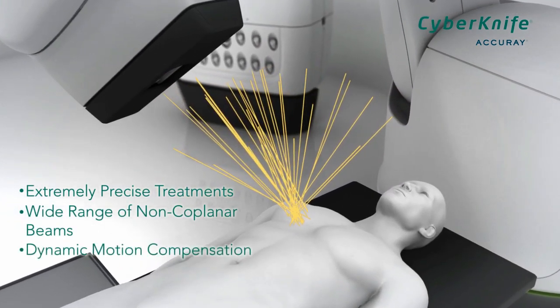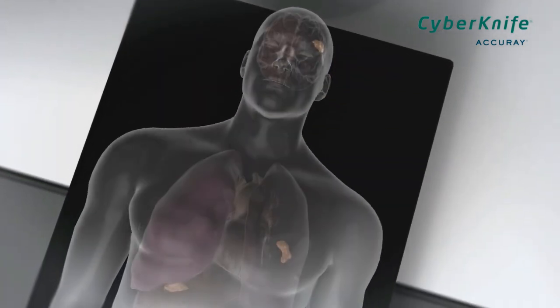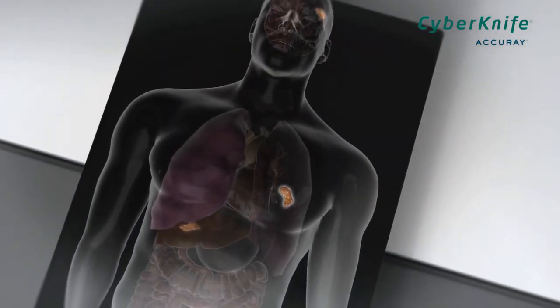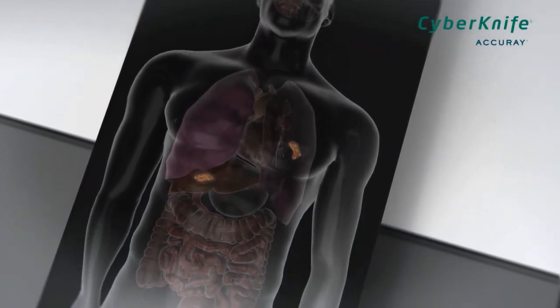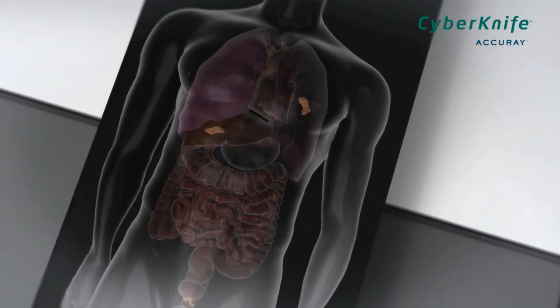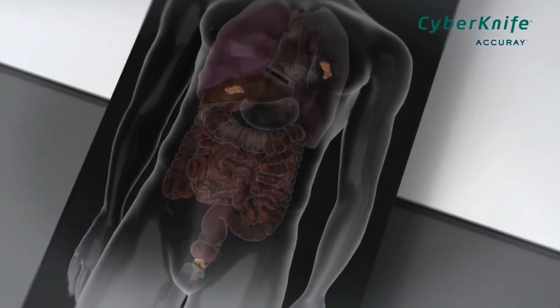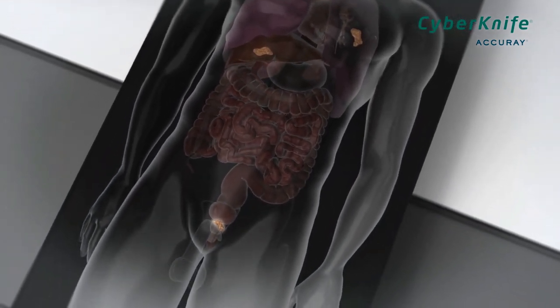Additionally, the workspace is comprised of pre-assigned points in space, termed nodes, where the manipulator is allowed to stop in order to deliver a radiation dose. At each node, the LINAC can deliver radiation from multiple beam angles.